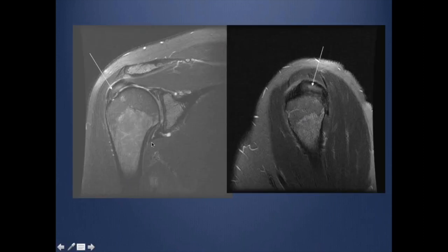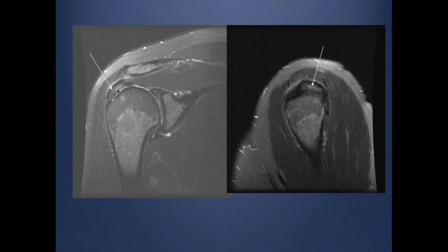As you see here, if you look at the supraspinatus tendon, it looks swollen and thickened, and there is internal intermediate signal intensity. We always like to see the tendon as a dark signal, particularly in sequences with high TE. This is where we are going to be confident in making diagnoses of either tear or tendinopathy, looking at sequences with either proton density or T2 with relatively high TE.